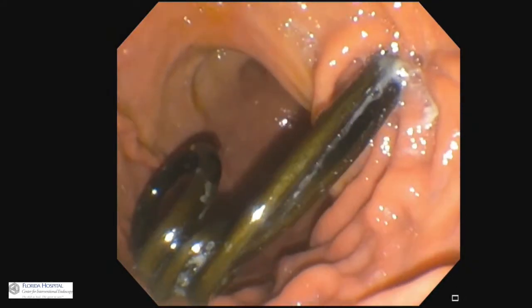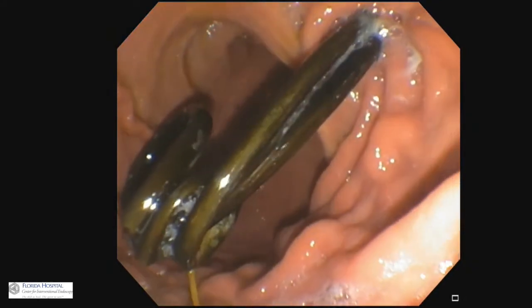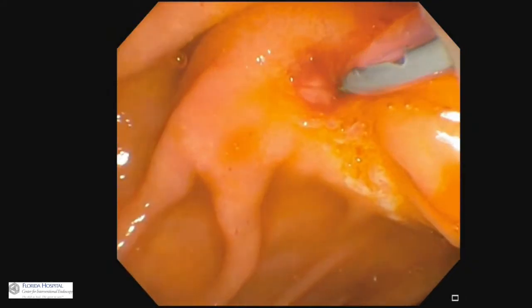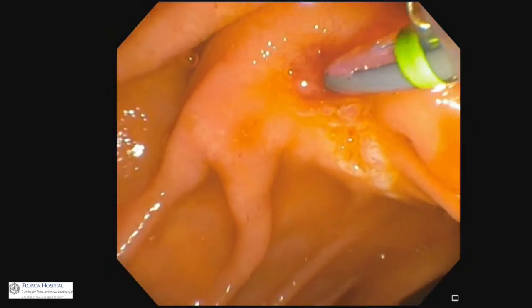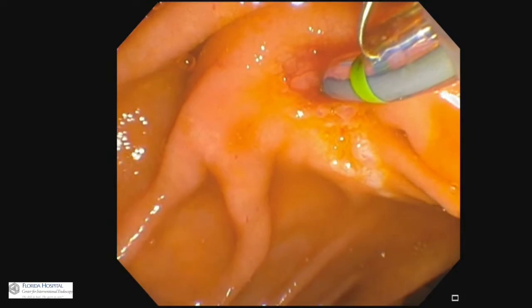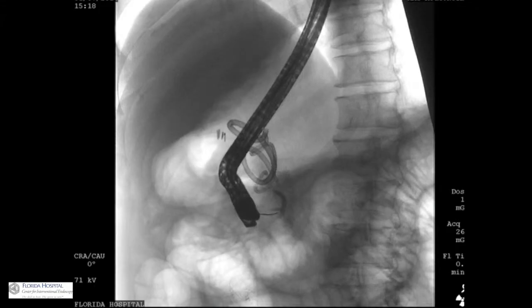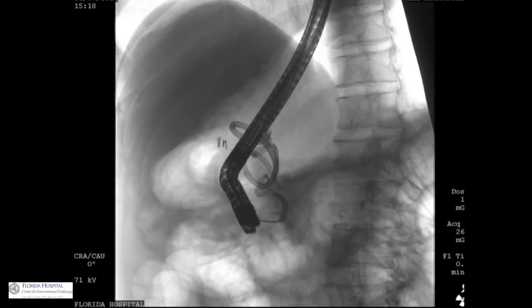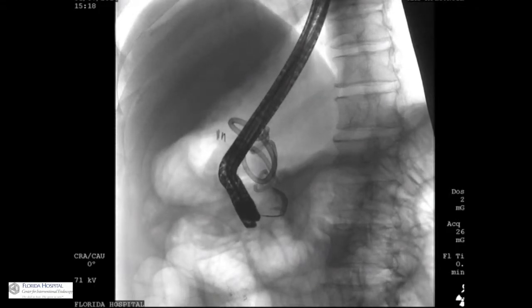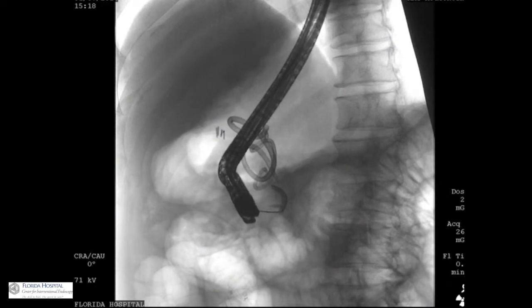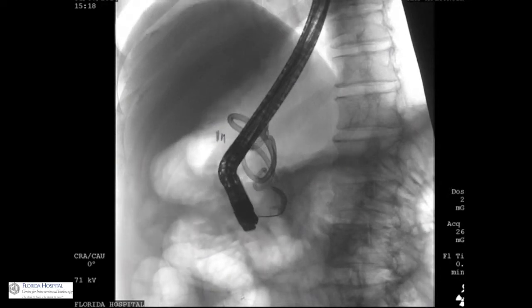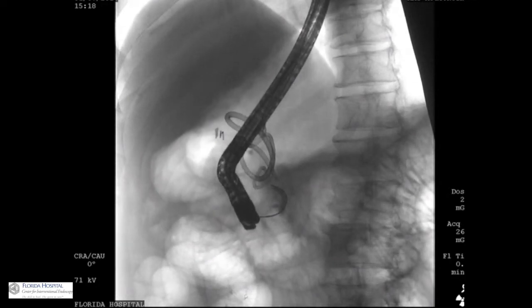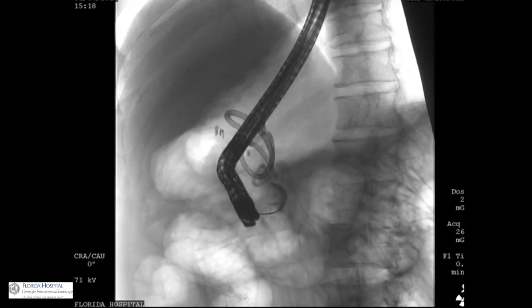This is a patient with a disconnected pancreatic duct following severe acute pancreatitis complicated by walled-off pancreatic necrosis requiring cyst gastrostomy. The pancreatic duct was completely transected on pancreatogram, and the pigtail stents were seen in the vicinity of the disconnected duct on fluoroscopy.